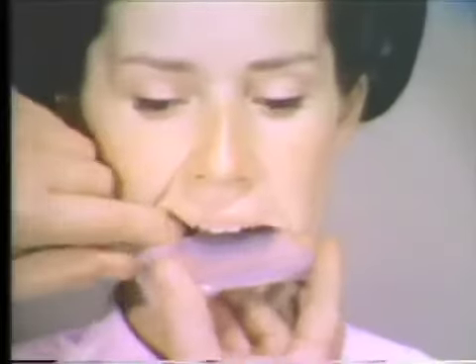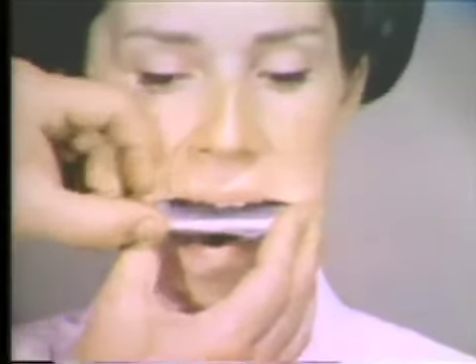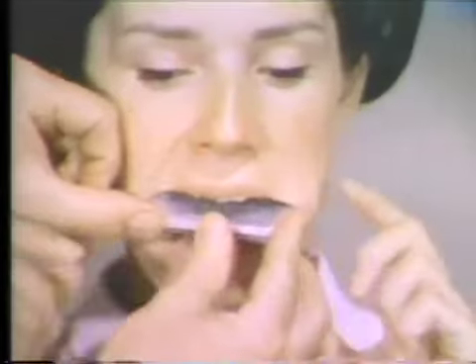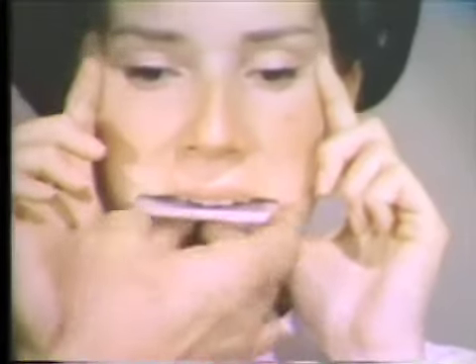The film is now inserted into the patient's mouth. The sensitive side is up with the R on the right side. When positioned, the cassette pack will be held against the teeth with the patient's thumbs because even light biting pressure will damage the cassette.